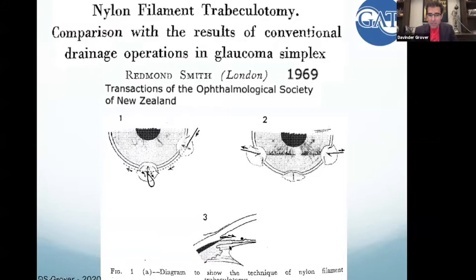And I love this picture right here. Because when you look on gonioscopy, you can see this. And this, I think, is important because when Schlemm's canal gets cannulated, it tears circumferentially when you pull, it pulls anteriorly and you create that long flap with this anterior cleavage.